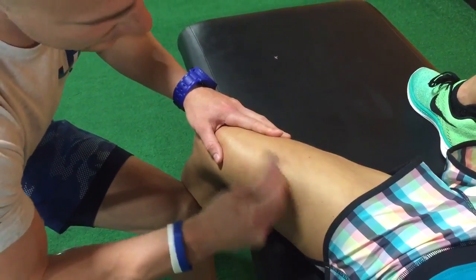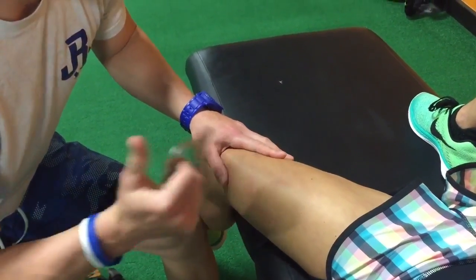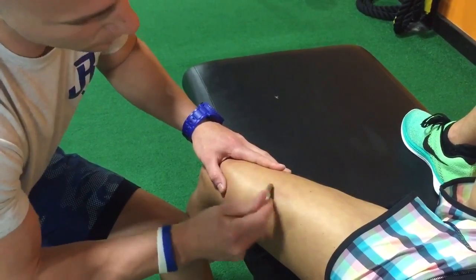This shouldn't feel like much of anything. If you have a practitioner that is scraping into you hard, go see a new practitioner. This should be light and quick, and it should really release some neurological tension very quickly if used correctly.